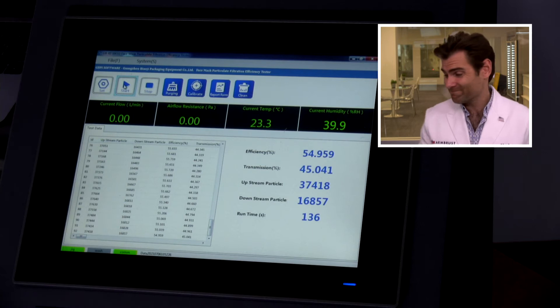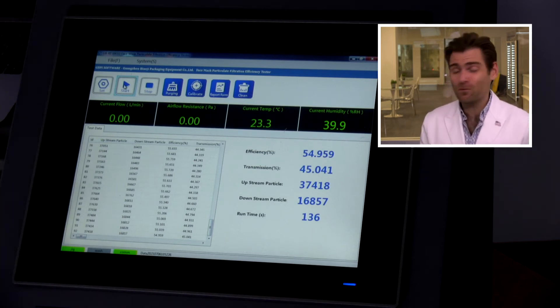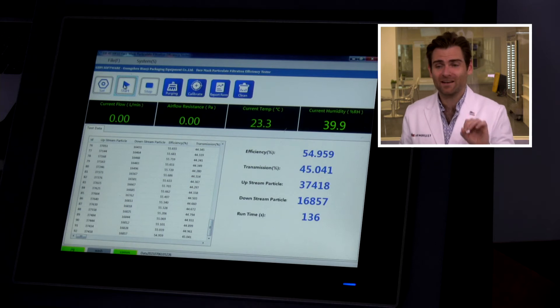So how does it match up? 54.9% — 54.959. Half of the stuff coming at you is going right through this mask. If it's something small like COVID, I don't like that at all. This may meet Indian standards, but I question whether even bacteria would get through at that rate. I can't grow bacteria here to test that claim, but I can say I would not wear this mask and I don't think you should either. It's just sad that this is one of the bigger brands in India and this is what they're giving people.